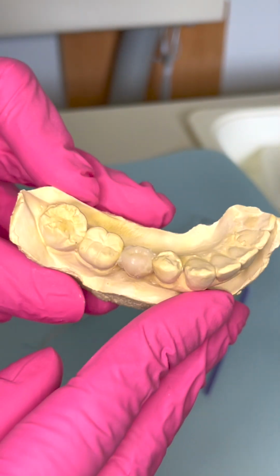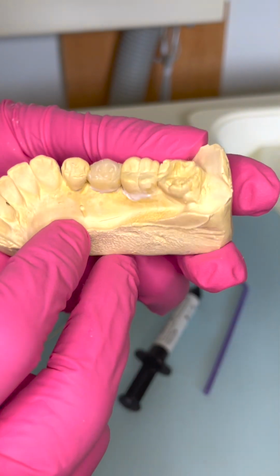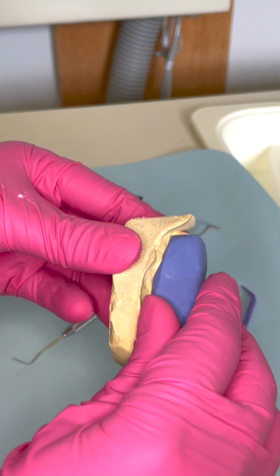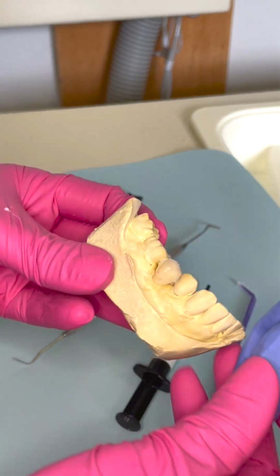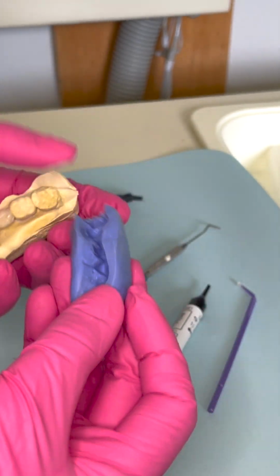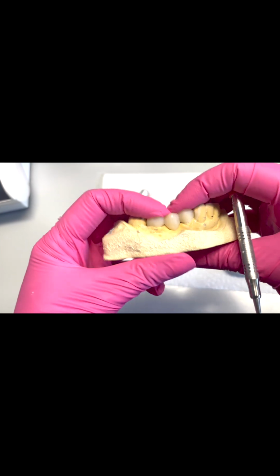And I'm pretty much done with my model here. It's just gonna reduce my chairside time significantly having this ready. You'll just fabricate an index out of this. Here's my index. And with that, I will fabricate the temporary bridge. And once I trim that temporary bridge and polish it and make it all beautiful, it's gonna look awesome. It's gonna be great for the patient.